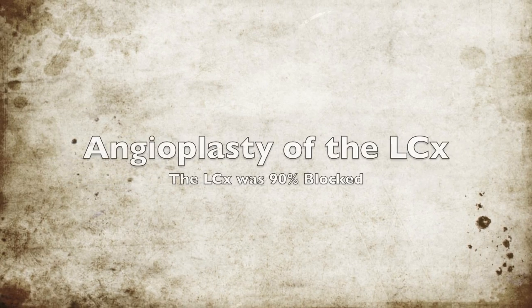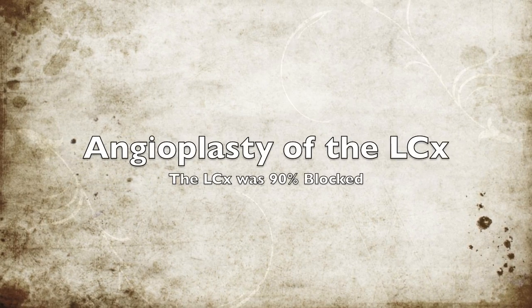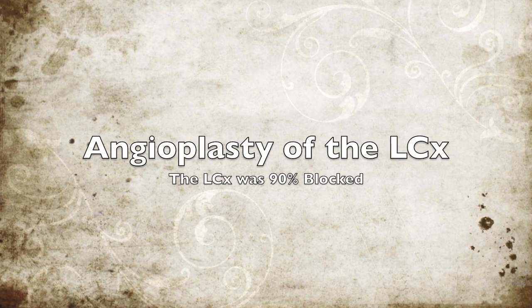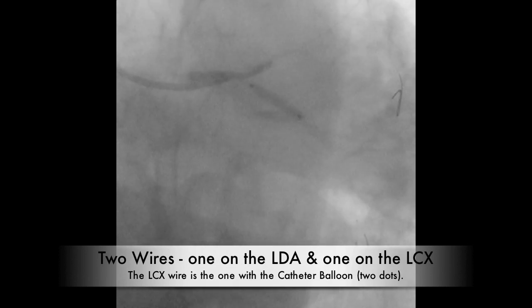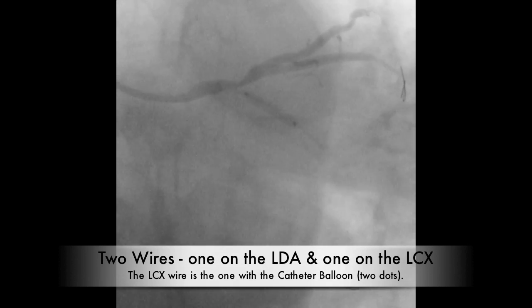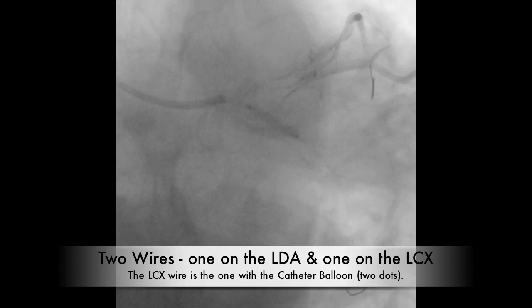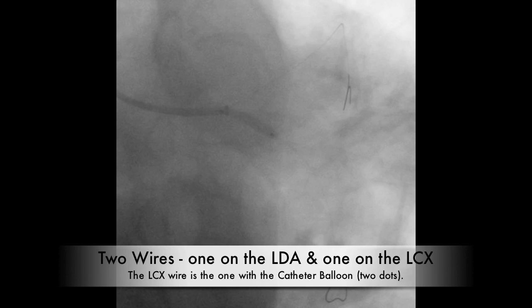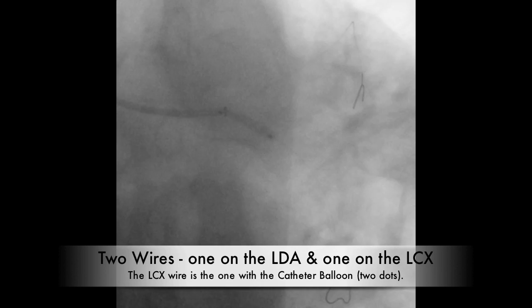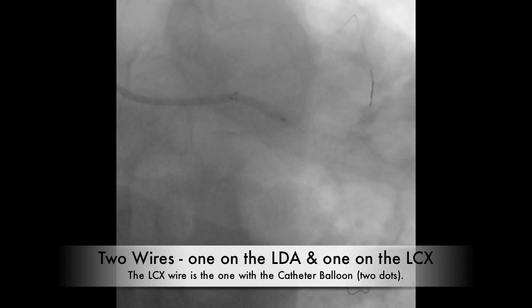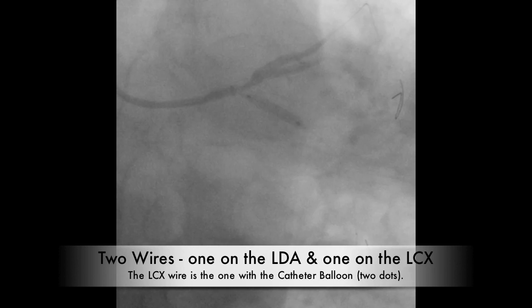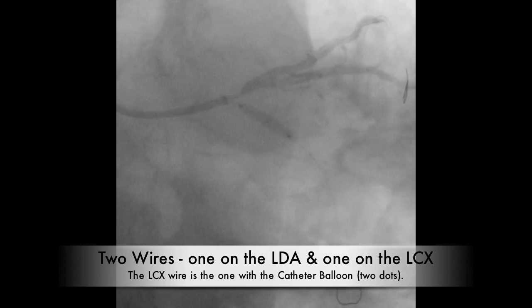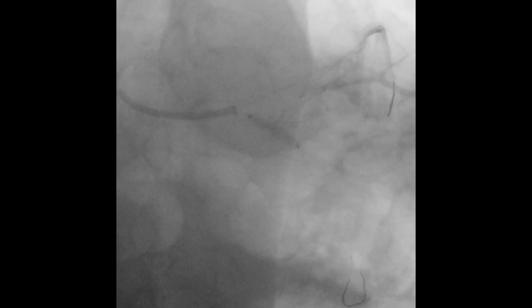Now we're going to look at the angioplasty procedure — the ballooning or inflation of the balloons. The angioplasty of the LCX or circumflex artery, which is 75–90% blocked. There you see the catheter balloon being pushed back. The catheter balloon has two dots on it so you can see them expanding it out at the junction where it was really thin.